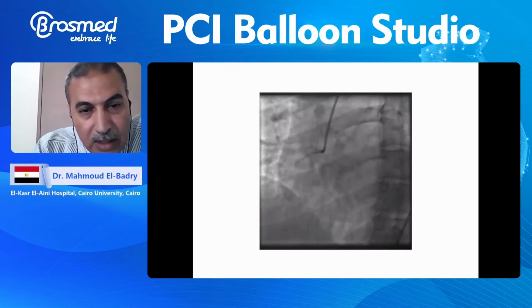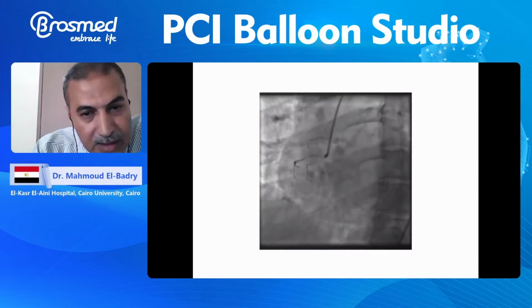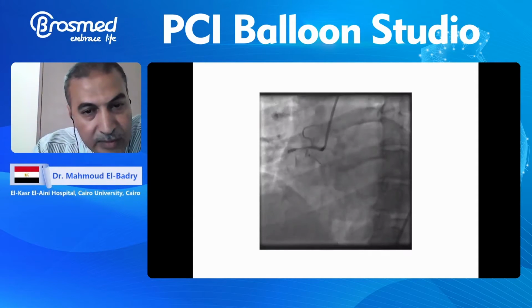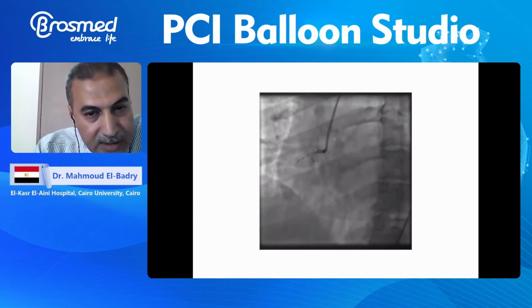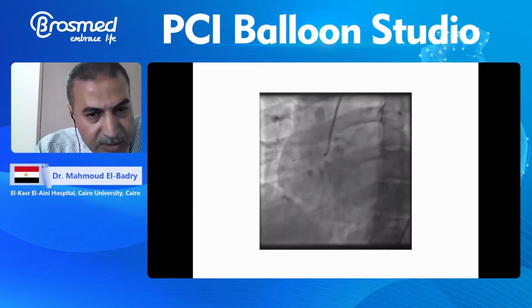So I succeeded to cross with further balloon support, as we see that it is more distal than the previous picture.